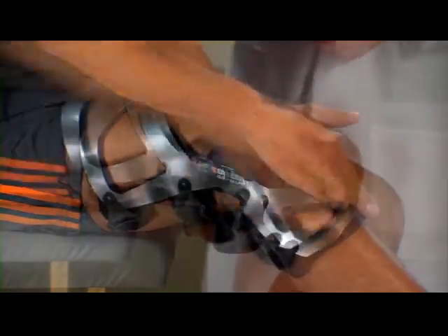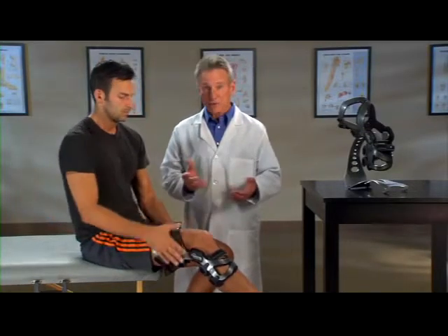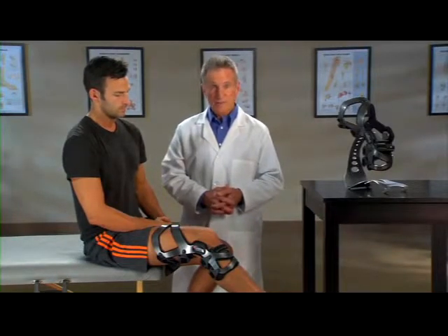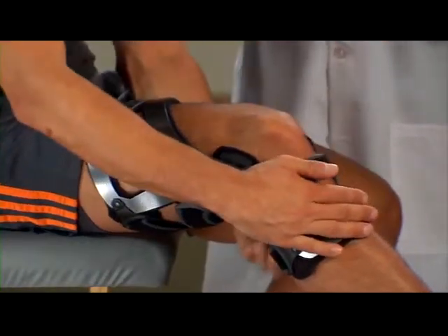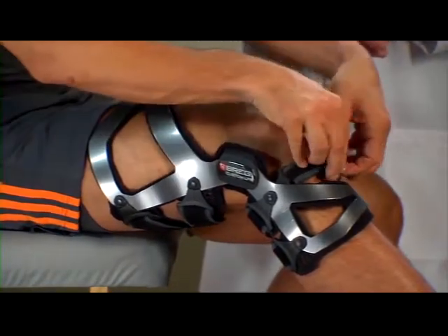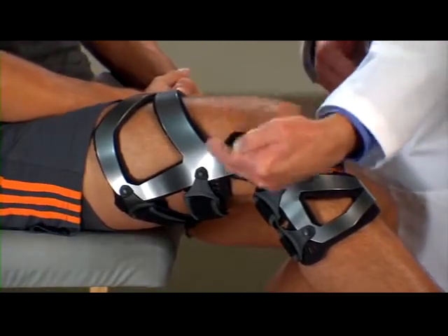Then fasten strap five in the back at the top of the brace. After you've been active for a while — about five minutes or so — your body fluid levels will change, making your brace feel loose. So you'll need to re-tighten the brace straps. Sit with your knee bent at a 30-degree angle like before, press the thigh and shin cuffs flat against the front of your thigh and shin, then loosen and re-tighten each strap one at a time in the proper order. Remember to apply equal tension. Be sure the brace hinges align with the top of your kneecap and that the hinges are at or slightly behind the midline of your knee.